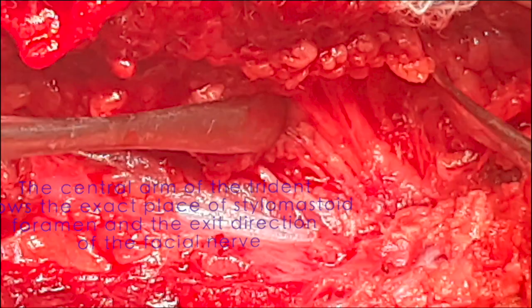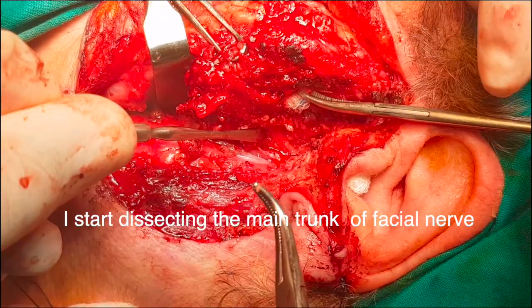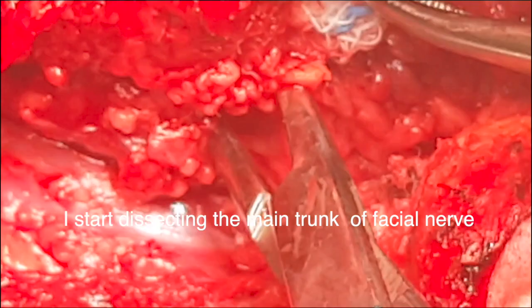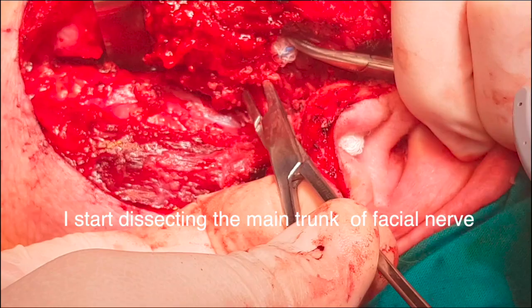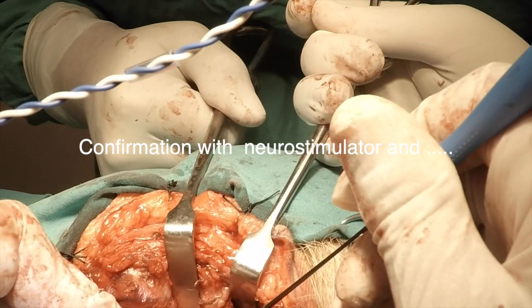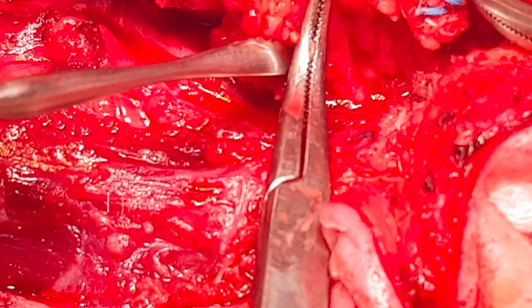Exactly in the middle of this distance, I start exploring the nerve. I start dissecting the main trunk of the facial nerve. Confirmation with a neurostimulator and monitor the recording. I find the bifurcation of the facial nerve.